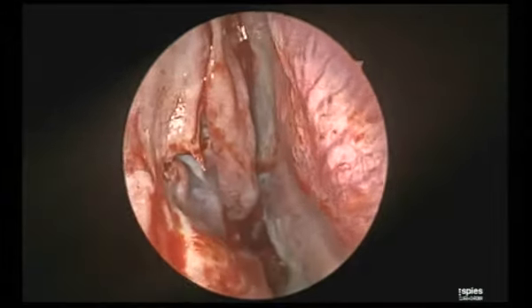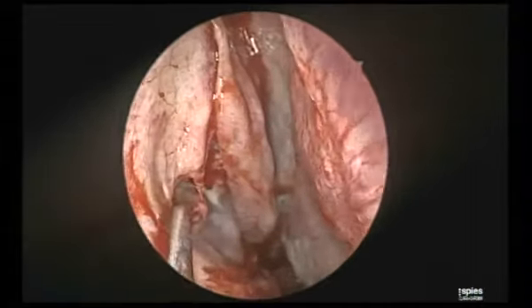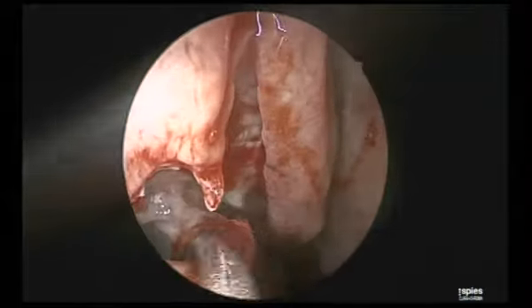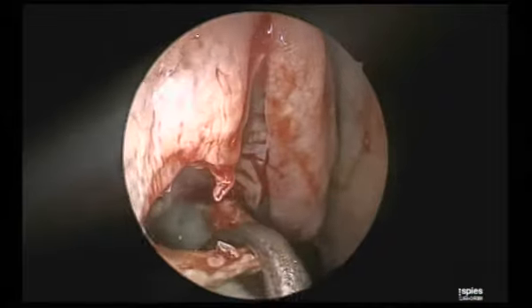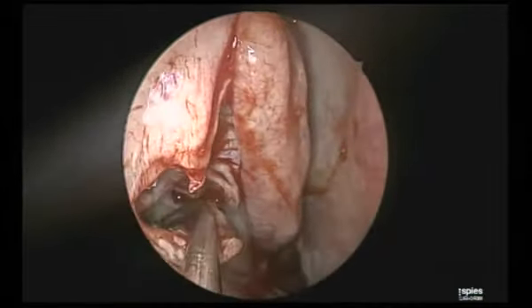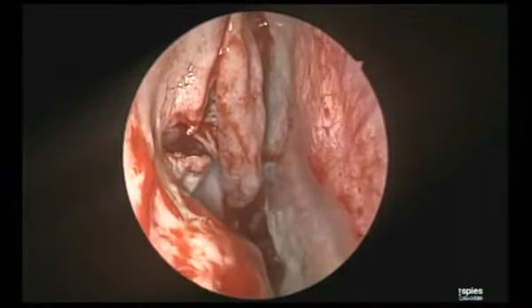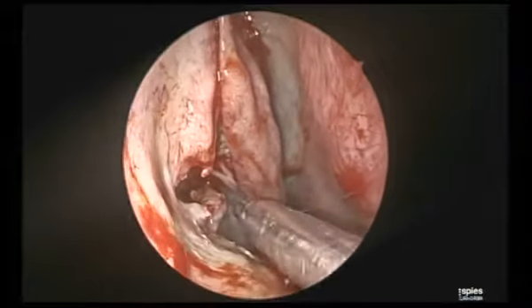Satish, an input from Gaurav. I think he's somewhere in the auditorium. The anterior end of the middle turbinate also has the highest density of receptors to assess airflow. If you take it off, the patient might feel that he's not having airflow. That's why it's better to preserve. Wonderful. Thanks, Gaurav. If you're somewhere around, please come. That's a good information. I've never heard it before.